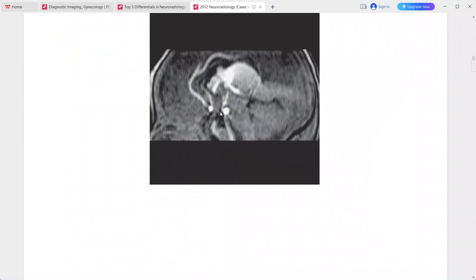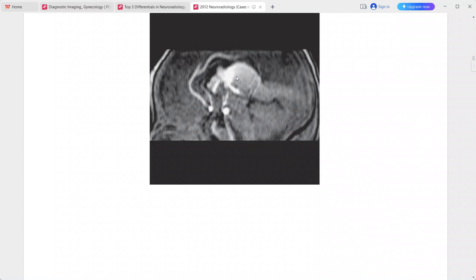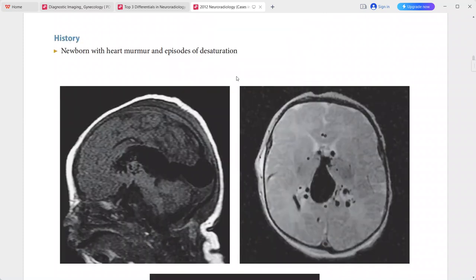Sagittal MIP reconstruction from MR angiography shows flow-related enhancement in enlarged arteries and the aneurysmal vein, consistent with a high-flow fistula. There is no hydrocephalus. This is a case of vein of Galen aneurysmal malformation. Differential includes vein of Galen aneurysmal dilatation.